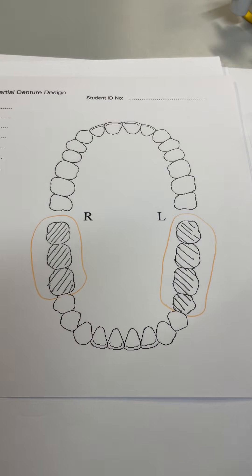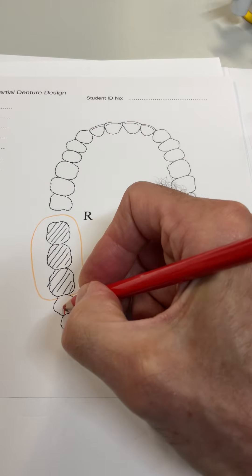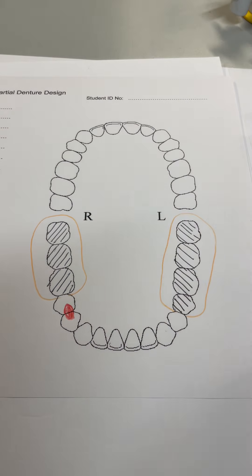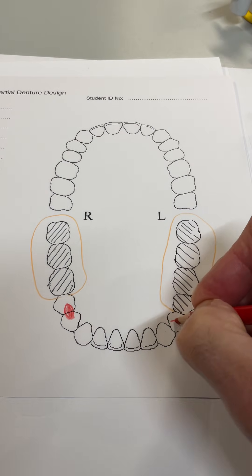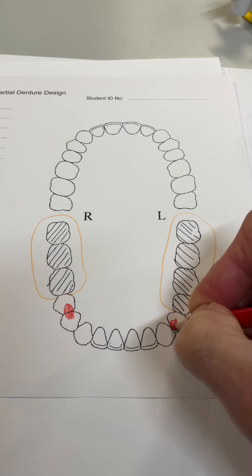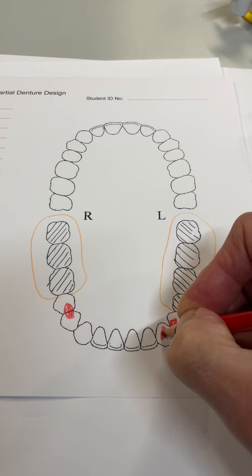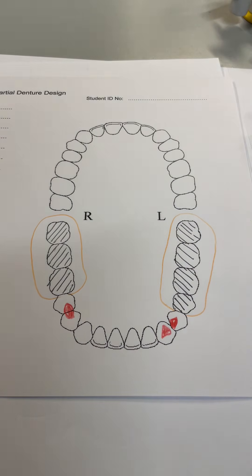We need some support. On this side we have two premolars, so we're going to utilise both — rest on the distal of the four, mesial of the five. On the other side we've only got one premolar, one occlusal surface, so we're going to use the four. I'm going to build up a cingulum rest seat in composite on the canine. Now we've got support.